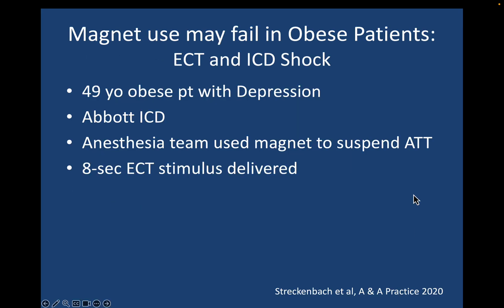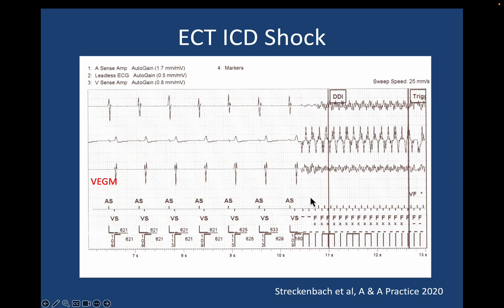Magnets may also fail in obese patients. This is an example of a patient who is having ECT, a 49-year-old patient. Abbott ICD, anesthesia team used a magnet to suspend the anti-tachytherapy, and an 8-second ECT stimulus was delivered. And you can see that the ECT stimulus starts here.